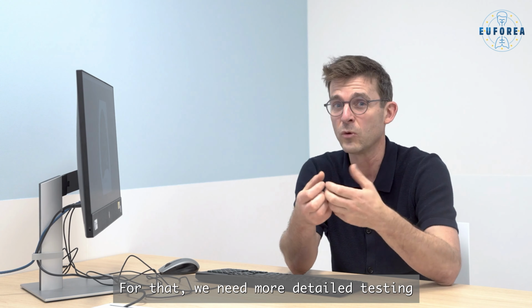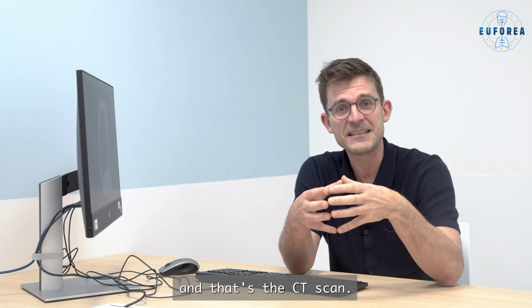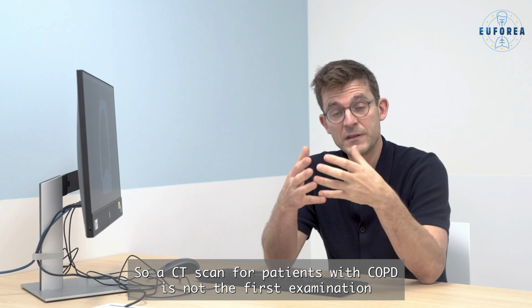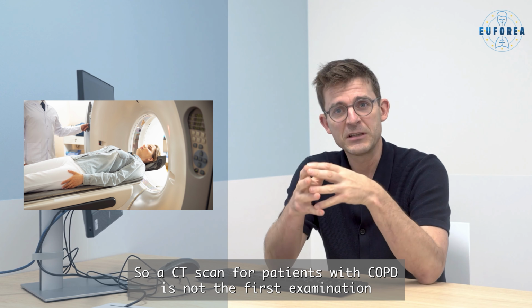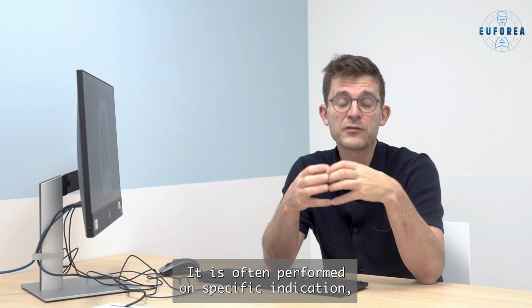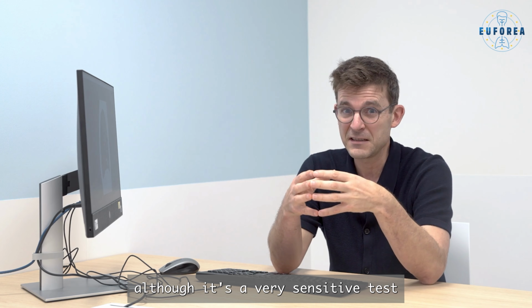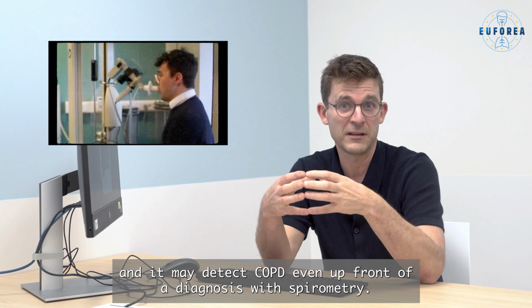For that, we need more detailed testing, and that's the CT scan. So a CT scan for patients with COPD is not the first examination that we perform. It is often performed on specific indication. Although it's a very sensitive test and it may detect COPD even ahead of a diagnosis with spirometry.